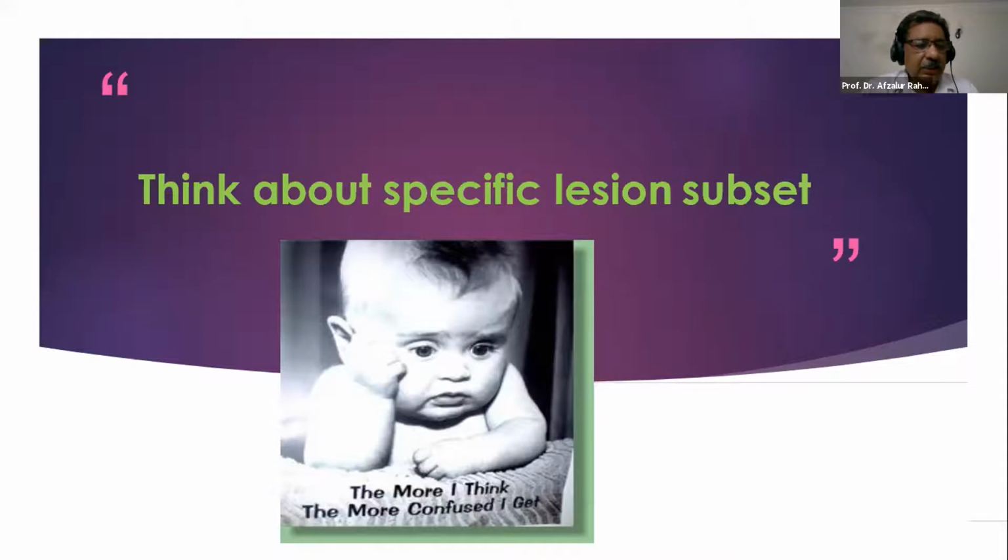Even in Canada, the insurance company sometimes does not cover the DES, and they are putting BMS stents. Patients from Bangladesh going to Canada get them. I put a Vision stent 4.5, a bare metal stent, in the left main ostium in 2012, because there was no DES of size 4.5 at the time. But the patient's follow-up is very, very good.